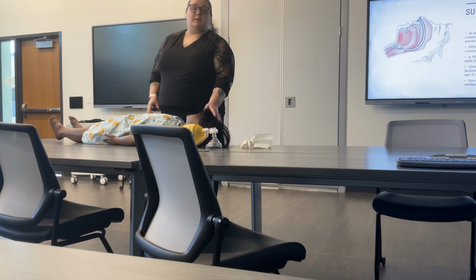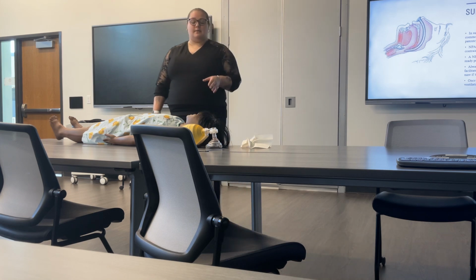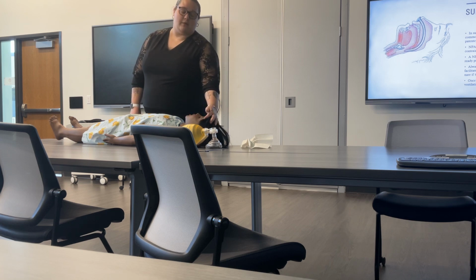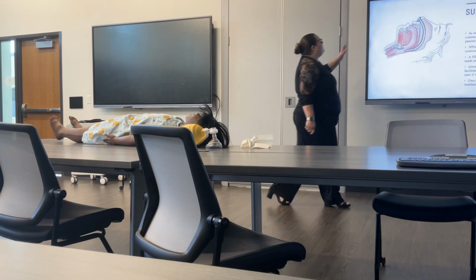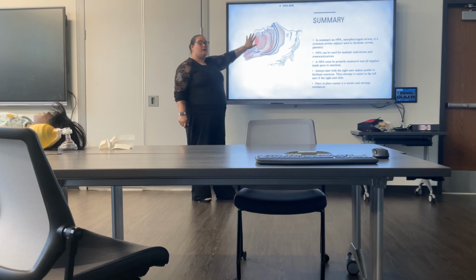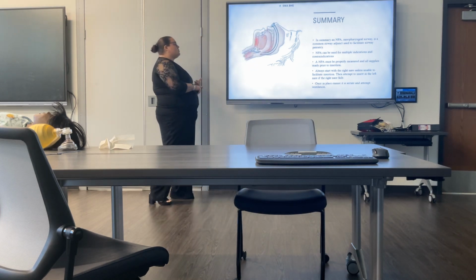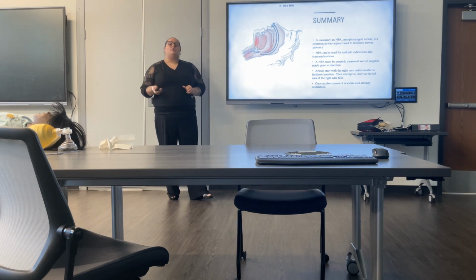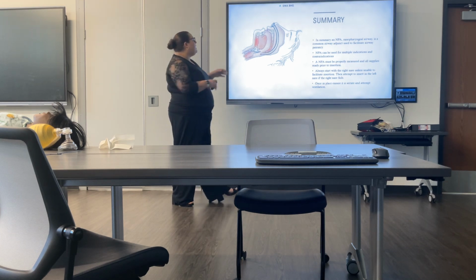And again, remember with these pediatric patients, their tongue is proportionately larger in their airway, so sometimes a mouth airway may not be the best solution for these patients, which is why we consider a nasopharyngeal airway. Your nasopharyngeal airway, again, goes through your nose into the nasopharynx, which is actually separate from your oropharynx. So sometimes this is a better solution for patients with issues with their mouth, issues with swallowing, structural abnormalities, if they're vomiting blood, anything like that. You do not want to place anything in their mouth to aggravate those things. So a naso airway may be better.